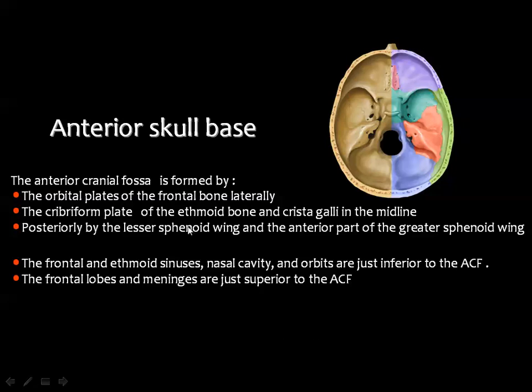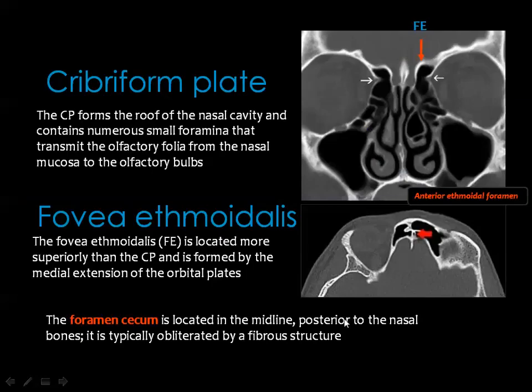The anterior skull base is formed by the orbital plate of the frontal bone, the cribriform plate of the ethmoid, the crista galli in the midline, and posteriorly by the lesser wing of the sphenoid as well as part of the greater wing of the sphenoid bone. The frontal and ethmoid sinuses, as well as the nasal cavity and orbits, are below the anterior skull base. The frontal lobe meninges are above the anterior skull base. These are images in the coronal and axial planes showing details of the anterior skull base.